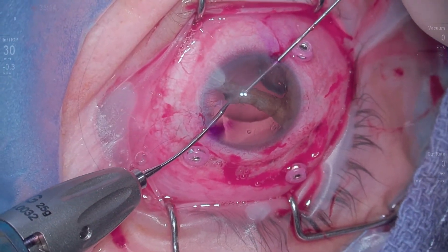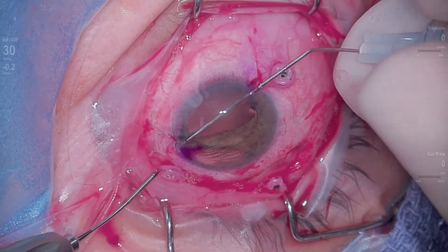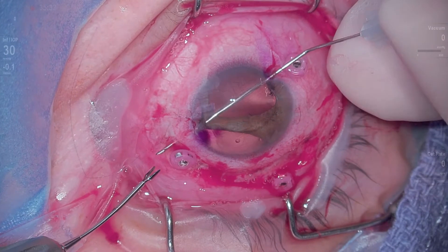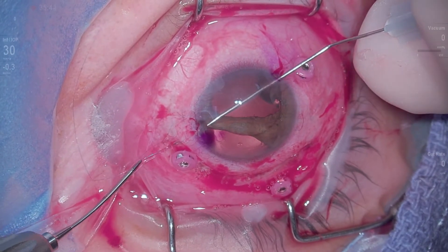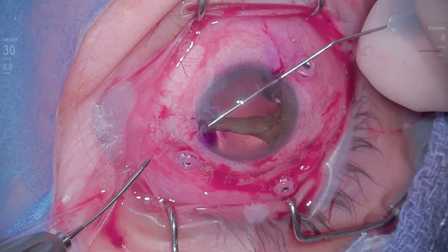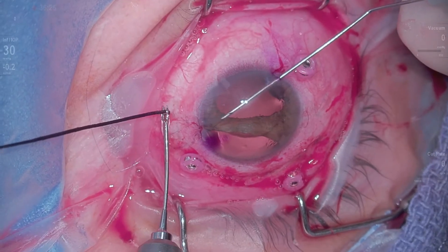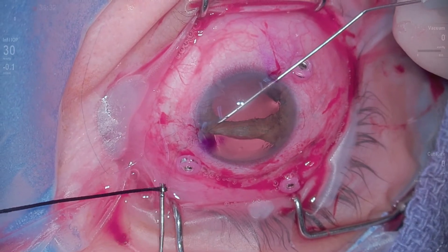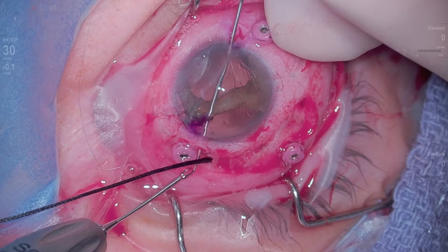I'll use my MSTs to help me, and right next to it I go back through and out through another part of the sclera. Now you can see I pull back a little bit — that gives me a loop. I'm able to externalize that proline now, and I want to keep that loop. I pull it back out, then take a 2-0 silk suture and feed it through this loop to keep the loop from going back into the eye.